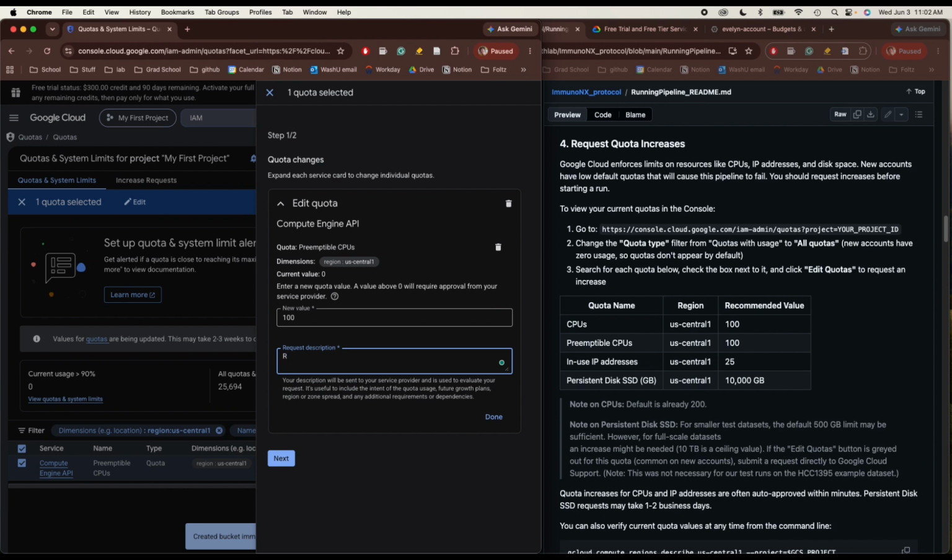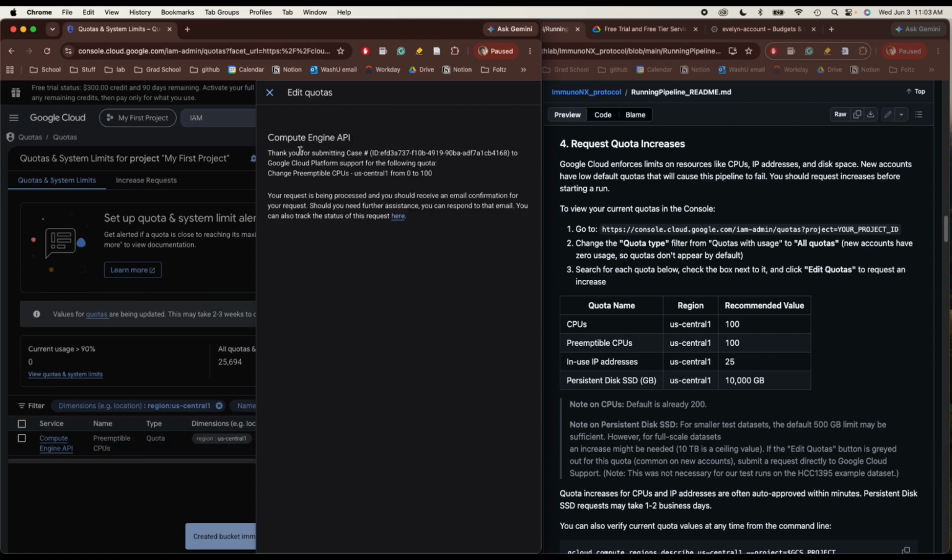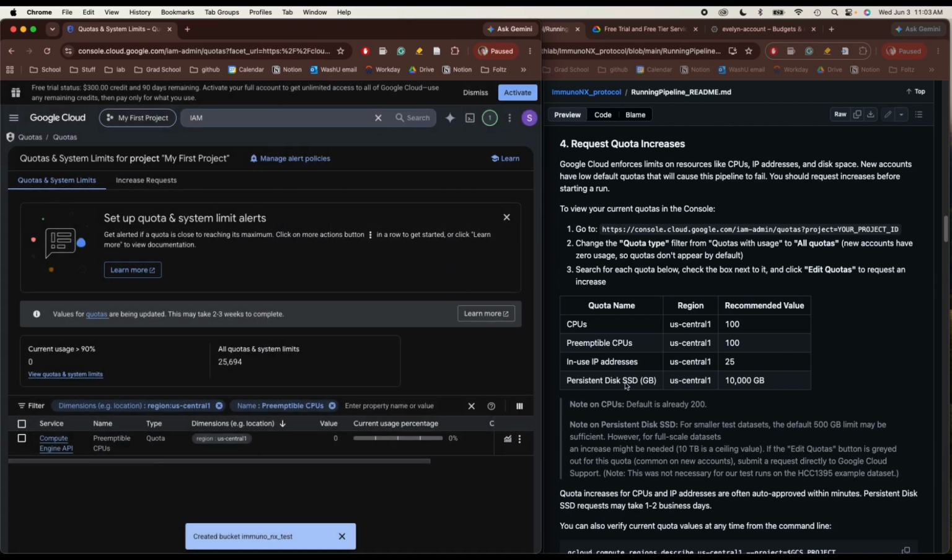And then this is submitting a request that should be approved pretty quickly, at least when I tried this the first time, it was. And the request has to be approved.